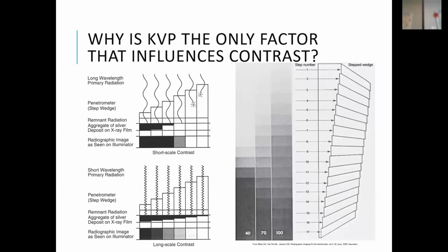So ours is 65 to 70, and that is kind of ideal because it has this really nice variation. You'd be able to see all the different little things like pathology, periapical abscesses, the start of decay, because it gives you all of this range of gray at 65 to 70.